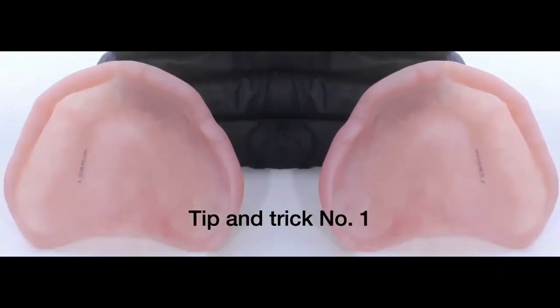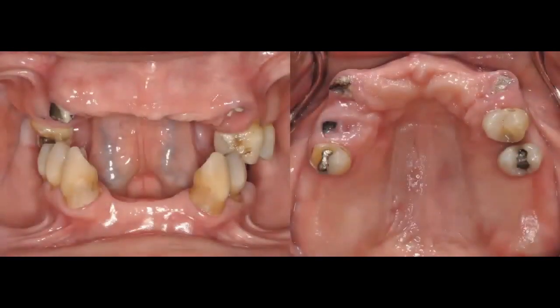We're going to start with tip and trick number one. If you have any questions, put them in the chat box and I'll address them at the end of the presentation. The first tip is about the importance of delivering an ideal interim denture.